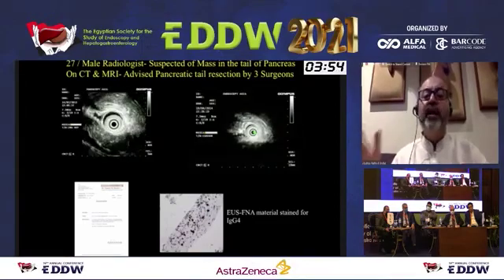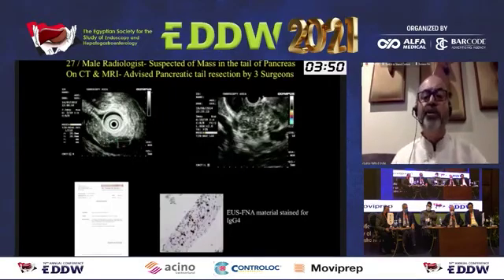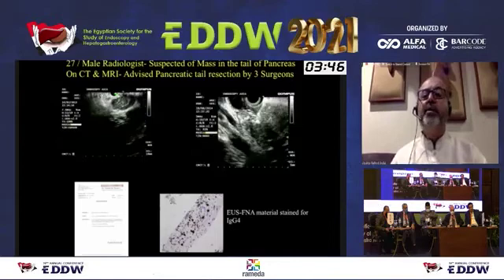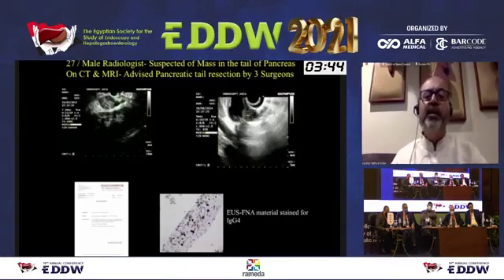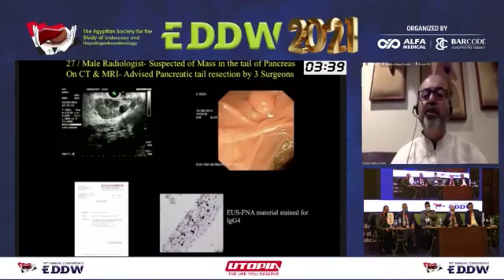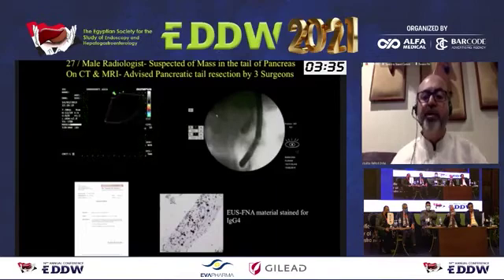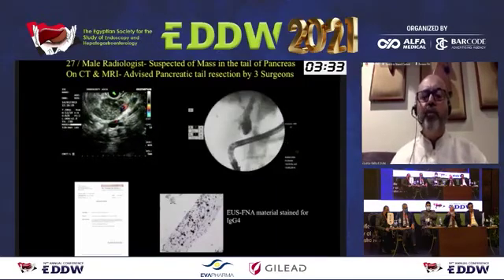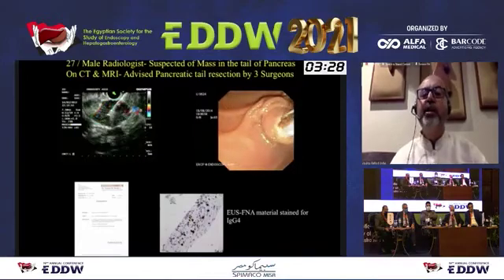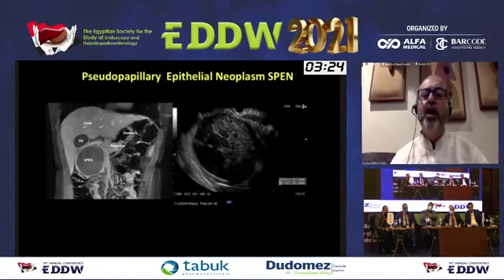So we always make sure that every patient, irrespective of whether they are resectable on other imaging or not, we take them at least for sonomorphological evaluation of the mass so that we don't miss any distant lymph nodes or minimal ascites and sometimes some pseudotumors like this which may come up and give a surprise. So autoimmune pancreatitis you need to keep in mind, and we also do ampullary biopsy according to the Japanese studies, but in my experience ampullary biopsy is not very helpful. I think EUS-guided core biopsy is extremely important for a diagnosis of autoimmune pancreatitis.